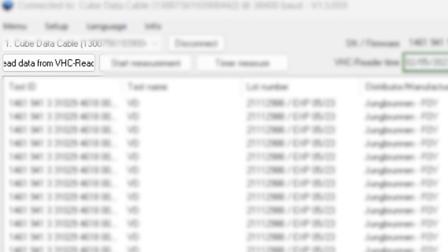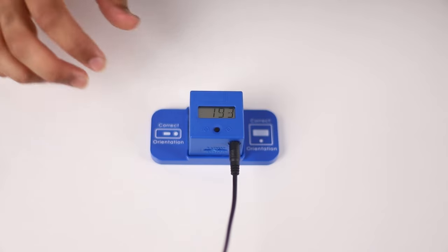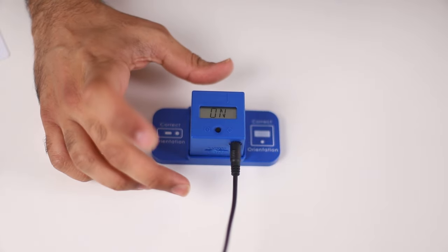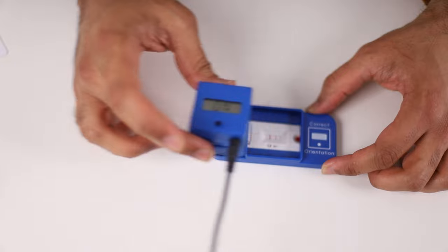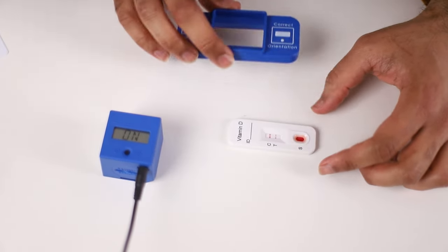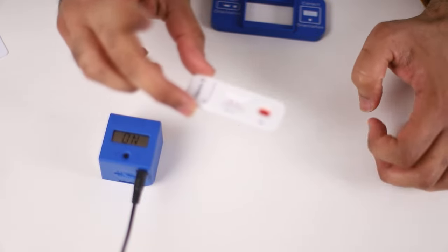You'll see the results display across the screen, but as the screen is quite small you don't really need to check results there — the results will be put onto the computer. To do this, simply click 'read data from VHC reader'. To clear this and begin a new test, simply press the button. Now that the vitamin D test is done we can remove the reader, take away the cassette, and dispose of the test strip.